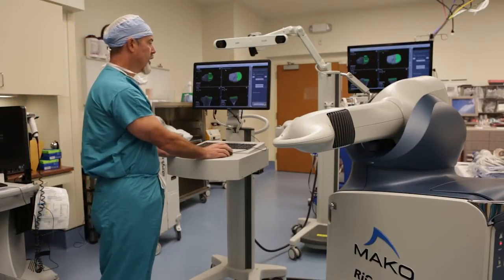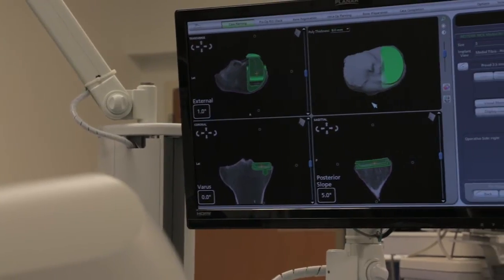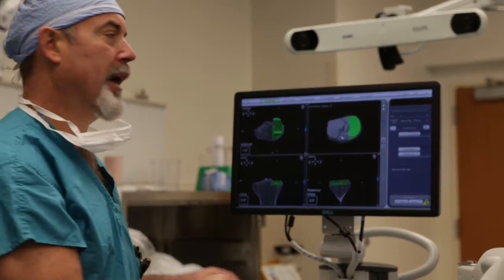Before the case, we come to the workstation. Before surgery, patients go to get a CT scan. That CT scan is then segmented into a three-dimensional bone model that allows us to do the preoperative planning very accurately.